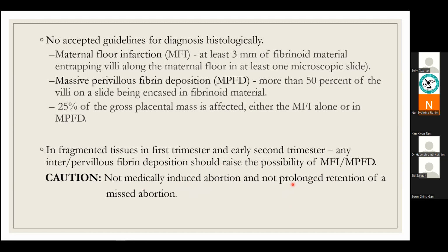Prolonged retention in missed abortion will also have a lot of perivillous fibrin deposition at the maternal floor. So if two of these are excluded and it's not in a fragmented lesion, then maybe you can offer MFI or massive perivillous fibrin deposition.